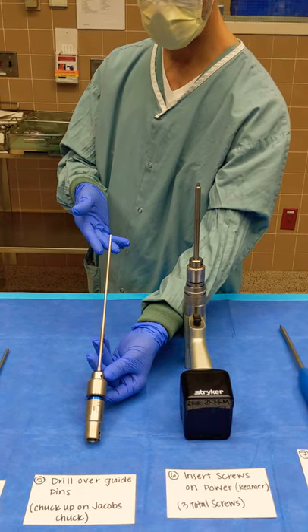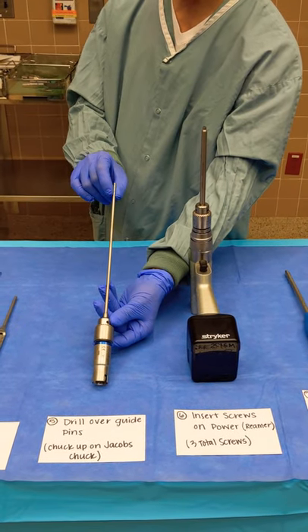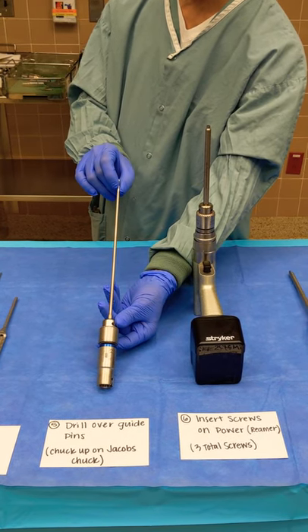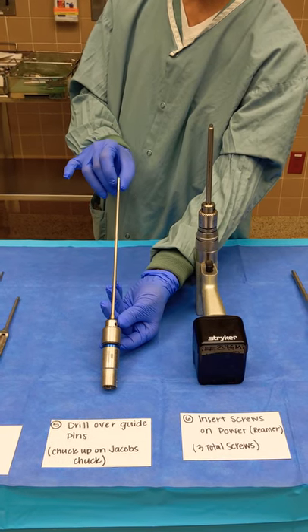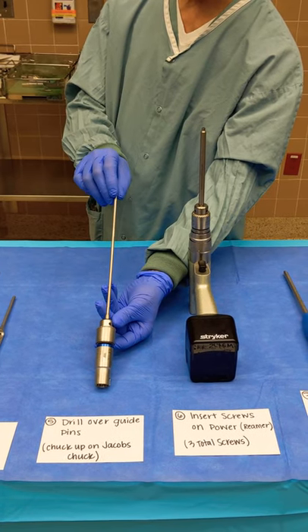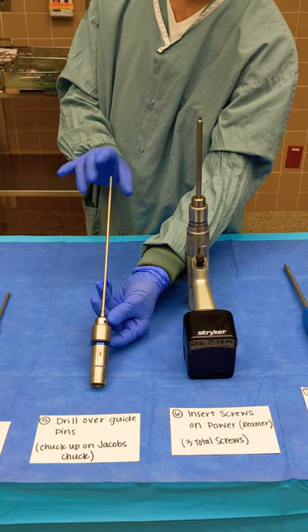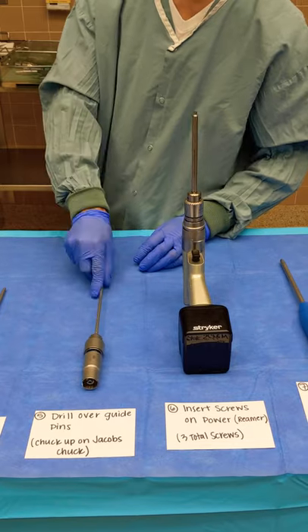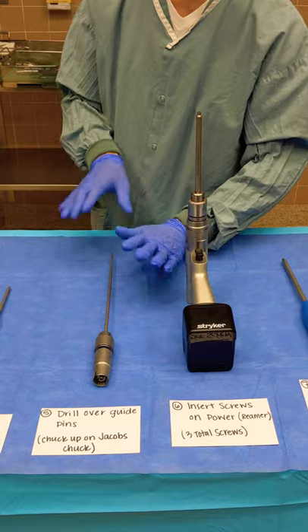They may choose to over-drill over the pins through the near cortex of the hip bone if the bone quality is still intact. As patients age, bone loses that integrity, so sometimes they may not use this drill — it's optional. If the bone is soft, they'll forego that step. But I would still have that ready on your Jacob's Chuck, ready to go.